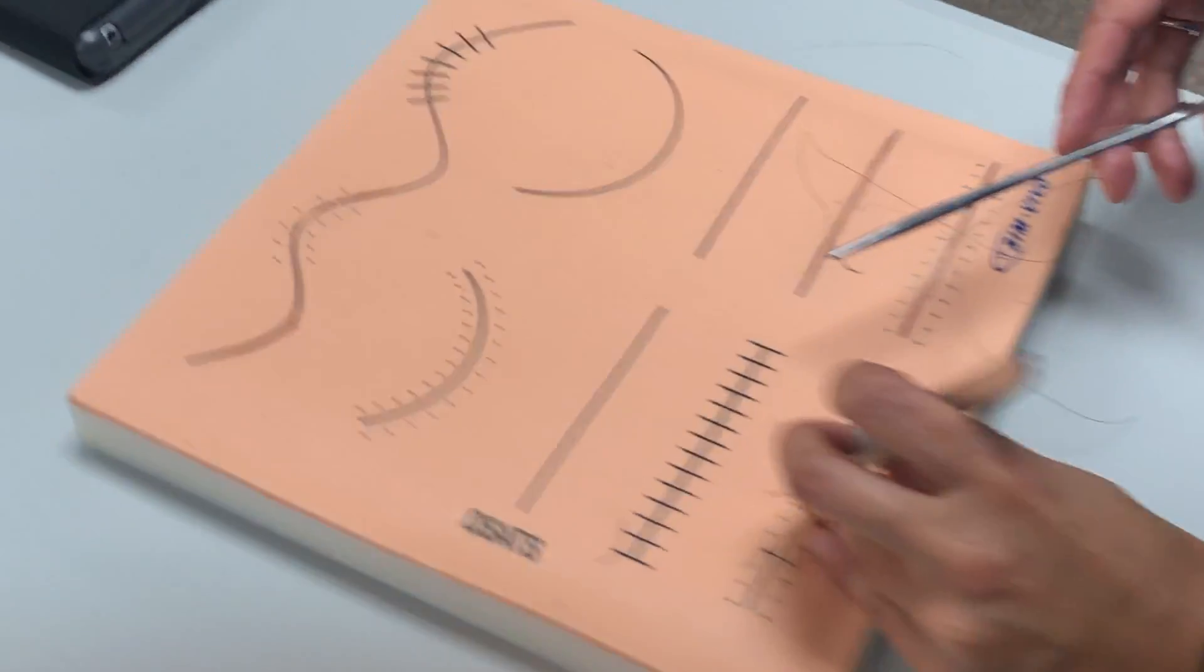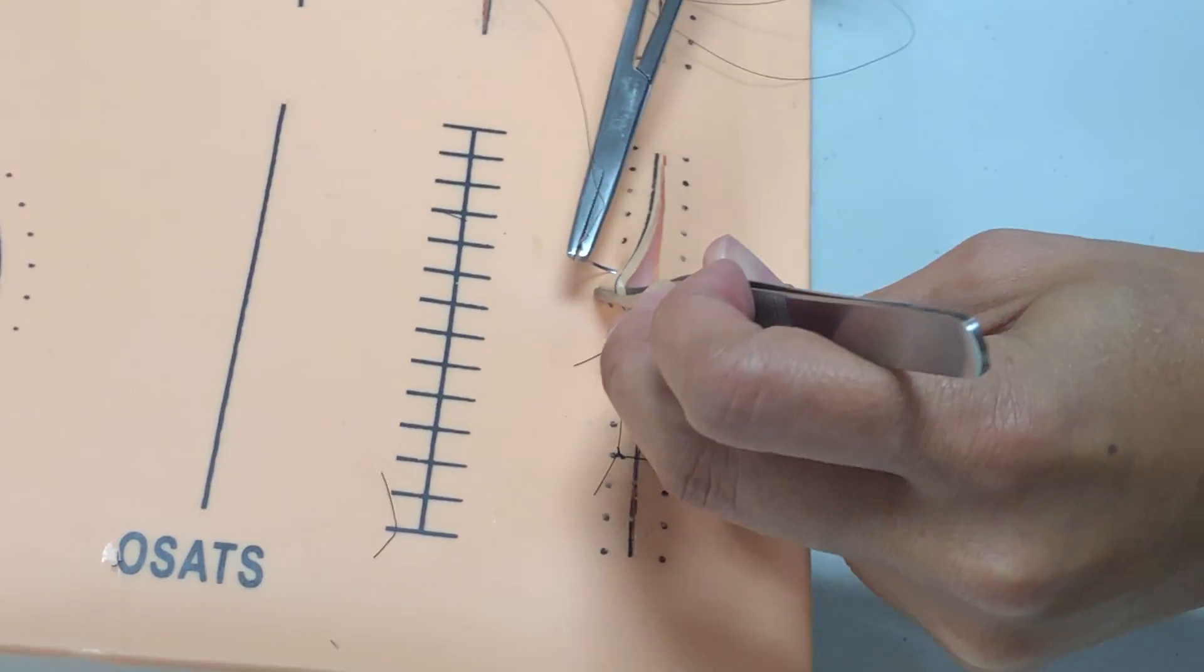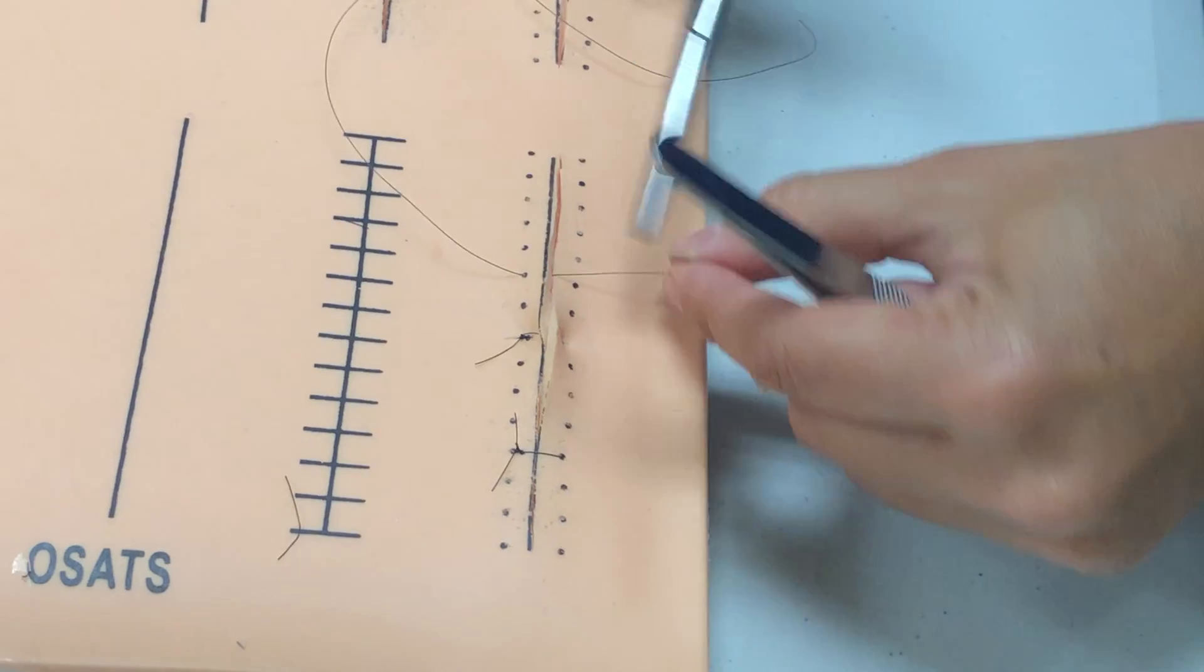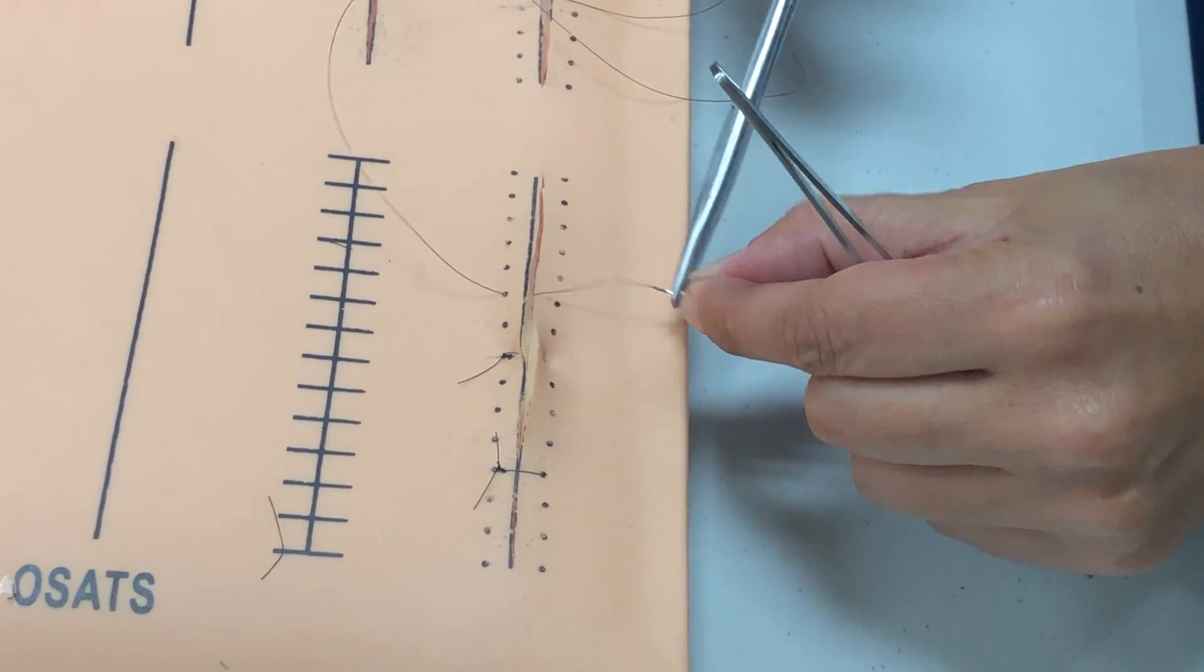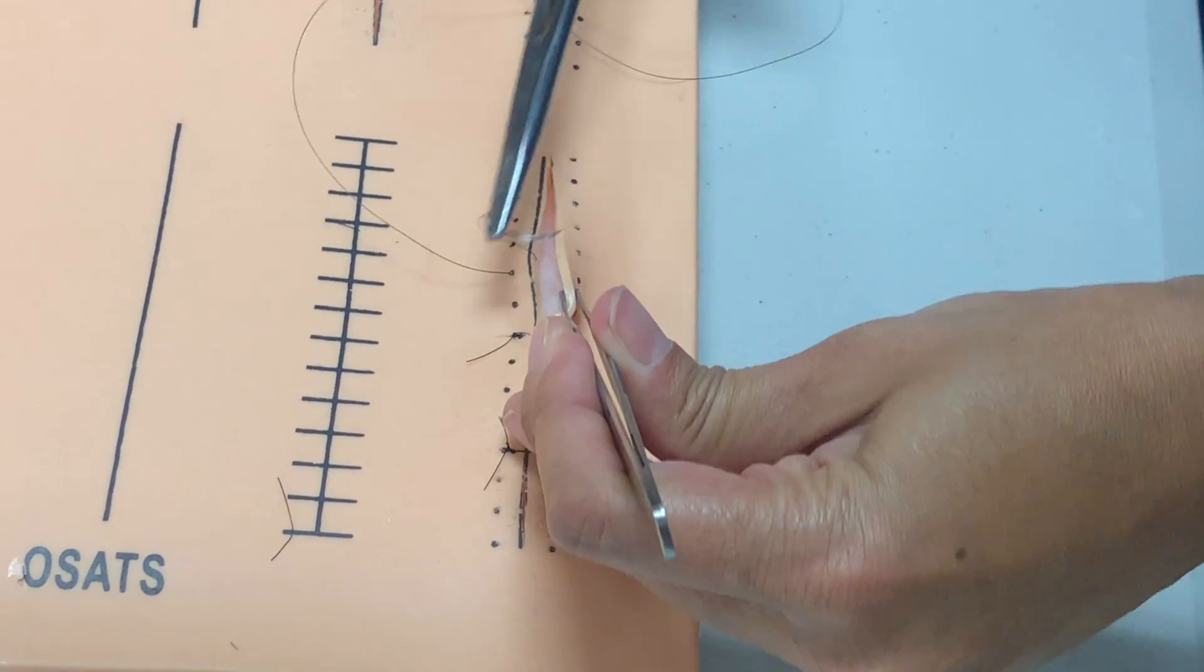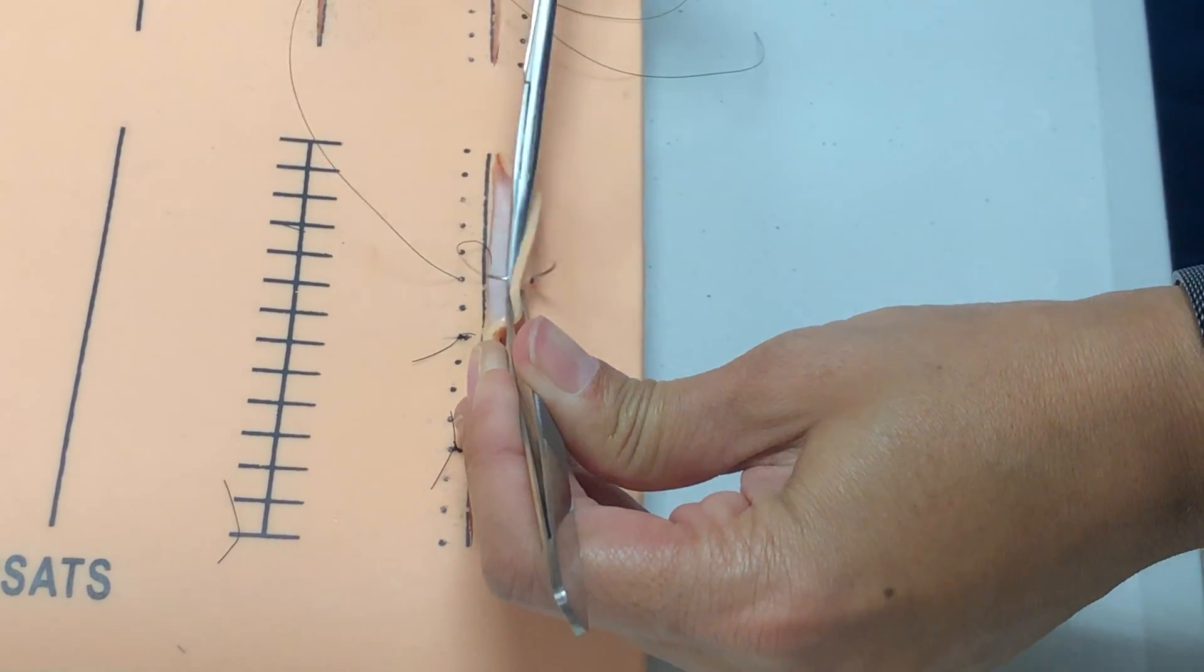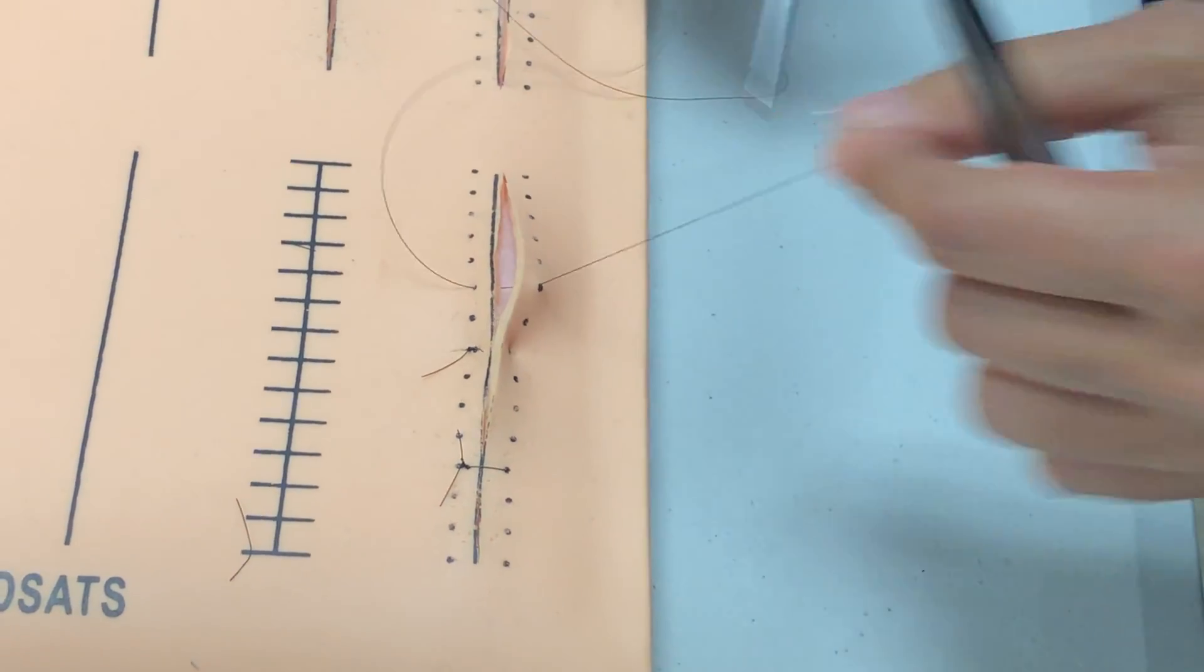So I'm going to start right here and I'm going to throw a stitch just like I would a simple interrupted. Reload, grab this, okay.